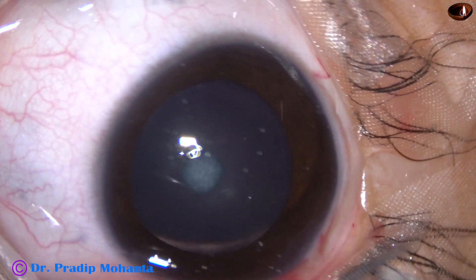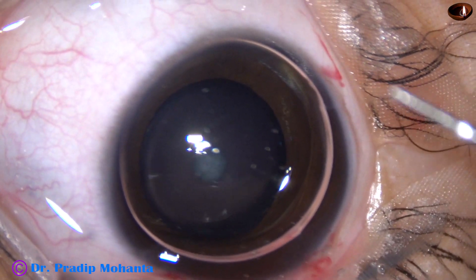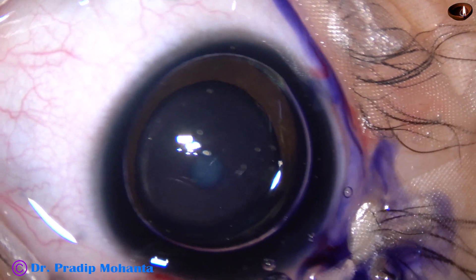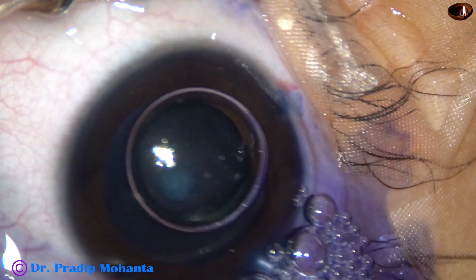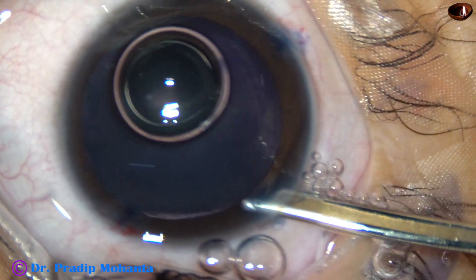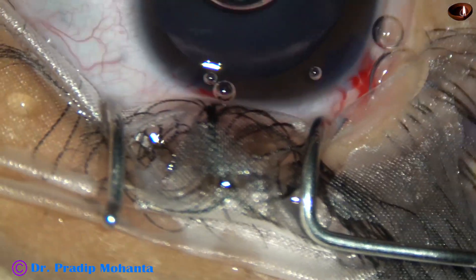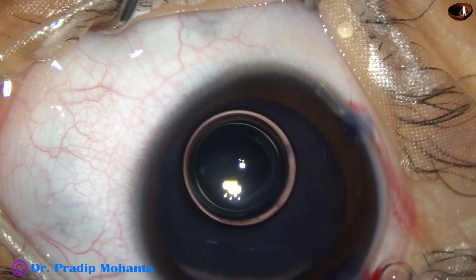Now I inject an air bubble. Beneath this air bubble, Trypan Blue dye is applied over the anterior capsule. It changes the elasticity of the anterior capsule and the rhexis becomes a little easier. Trypan Blue dye helps in two ways in pediatric cataracts: by giving more contrast and by changing the elasticity of the anterior capsule.